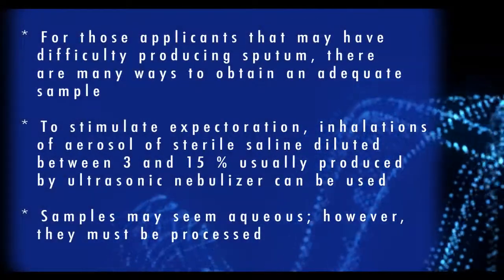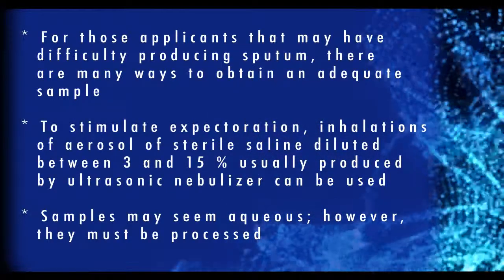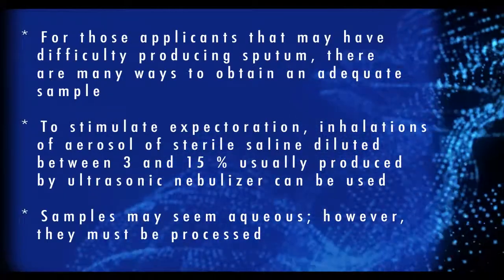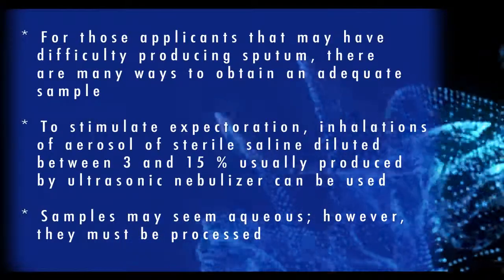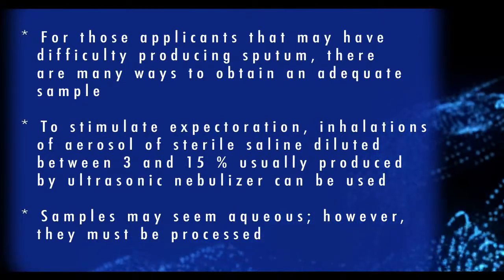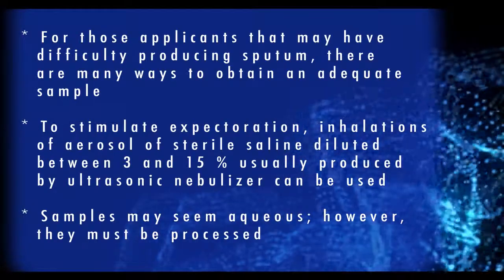For those applicants that may have difficulty producing sputum, there are many ways to obtain an adequate sample. To stimulate expectoration, inhalations of aerosol of sterile saline diluted between 3 and 15%, usually produced by an ultrasonic nebulizer, can be used. Samples may seem aqueous, however, they must be processed.